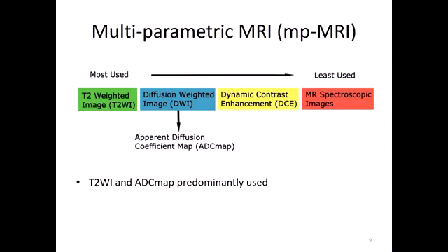And from these, the apparent diffusion coefficient map is created from the MRI imaging software. And it's the ADC maps that are used in the image analysis. These will show a darker spot: the darker the area, the less diffusion is shown. And that's how you can tell from there.